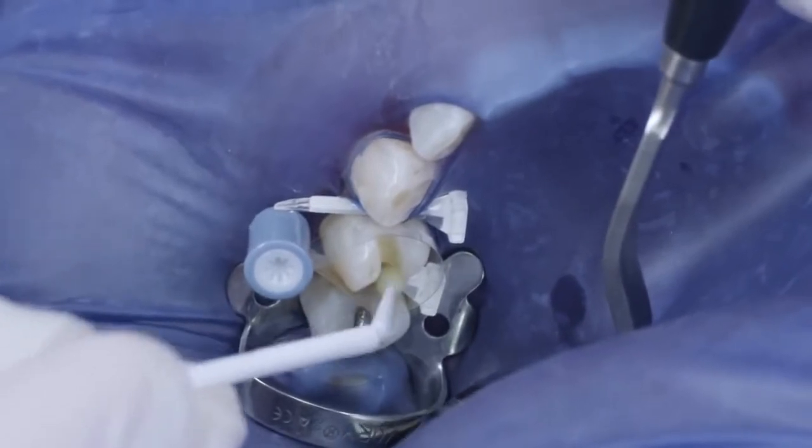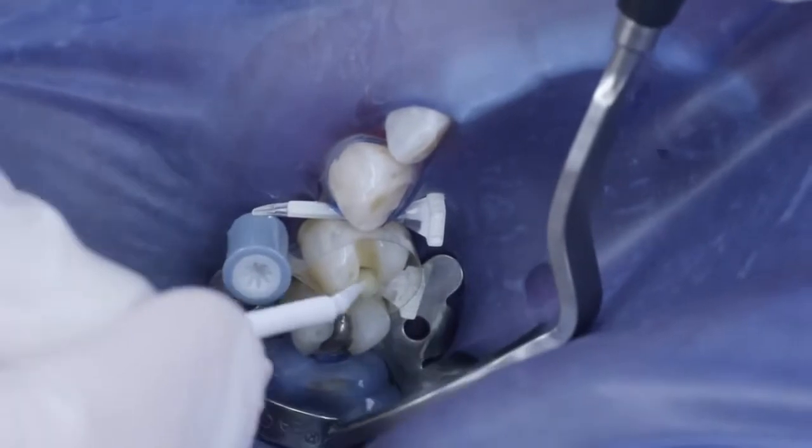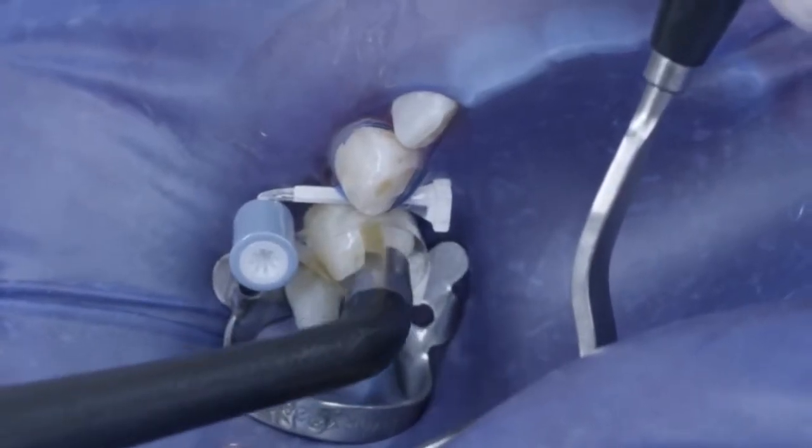For the bonding procedure, I chose the self-etch system iBond Self-Etch, which was placed in the cavity and actively moved within the cavity for 20 seconds.